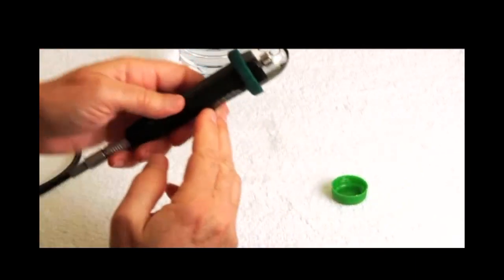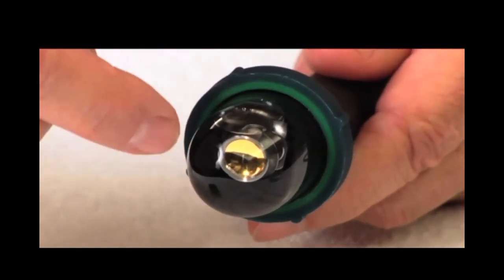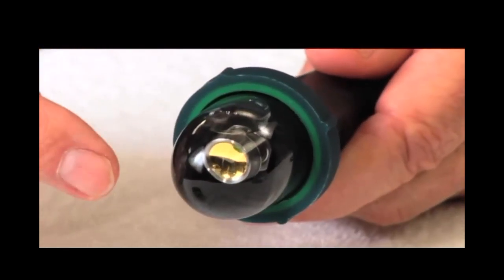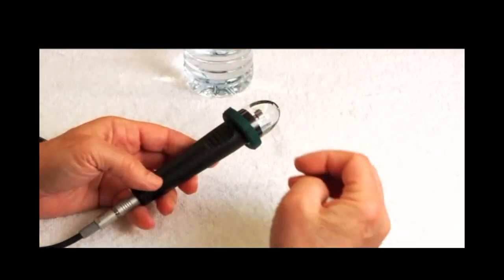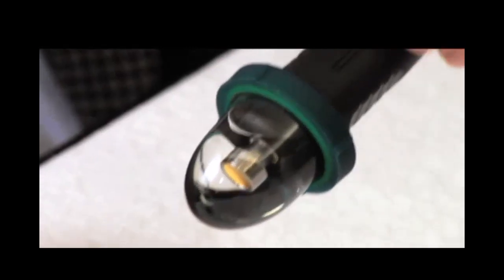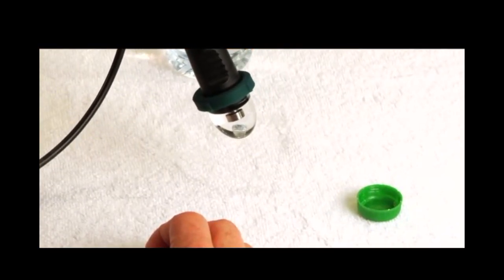What's important in doing this exam is to maintain a conical bullet shape to the ClearScan itself where it's in contact with the eye. I use this for aiming, especially an eye that has narrow fissures. And if it's too bulbous, it's going to roll over the lids. There's an air bubble in here, but if you do the examination, you can see it rises to the top. It really doesn't make any difference whatsoever.